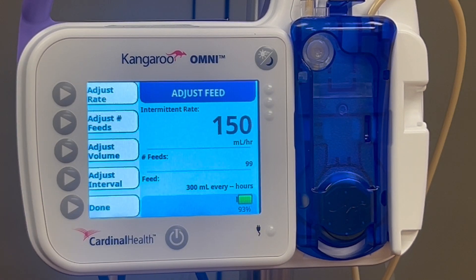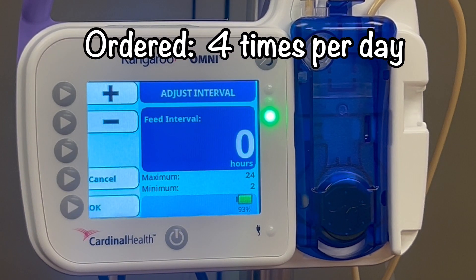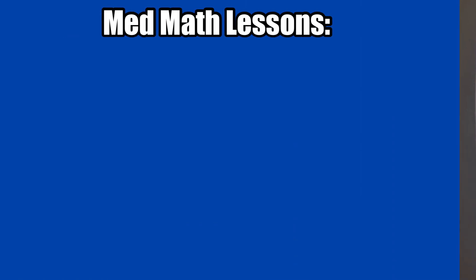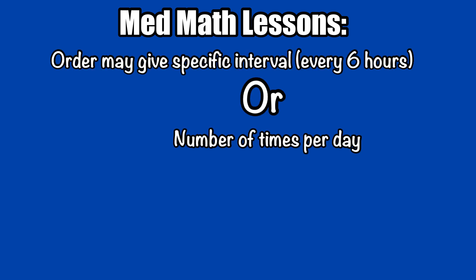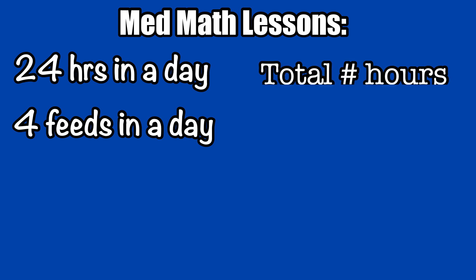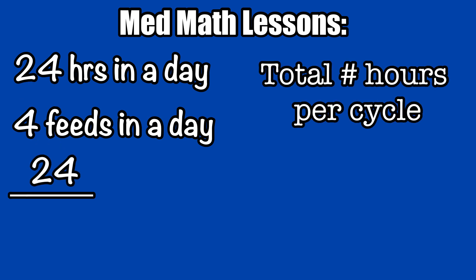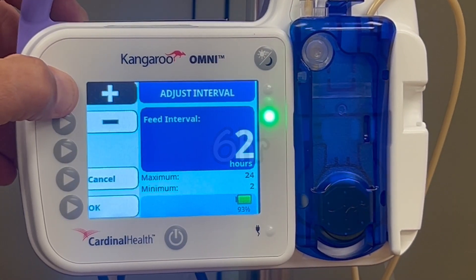When you change the number of feeds to anything other than 1, you get a new programming option: Adjust Interval. Choose that option. We know that our patient is supposed to receive this bolus 4 times per day. That doesn't give us a specific interval, so we'll need some math — though it is possible your order may clearly specify the intervals in hours. There are 24 hours in a day, and over those 24 hours we want to evenly space 4 feedings. Take the total number of hours in a day — 24 — and divide by the total number of boluses in a day — 4 — to give you the hours between boluses: in this case, 6 hours. Input that into the pump.